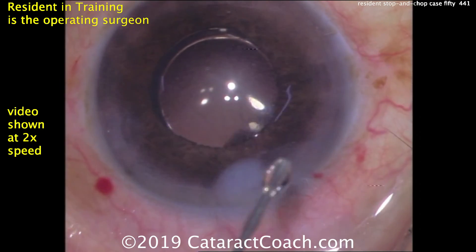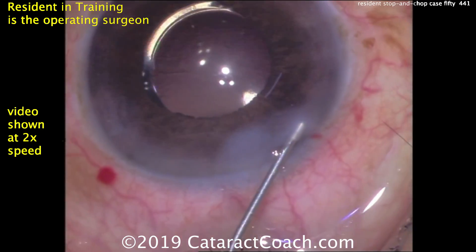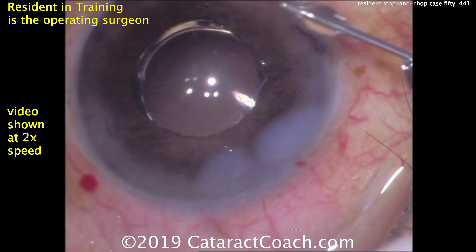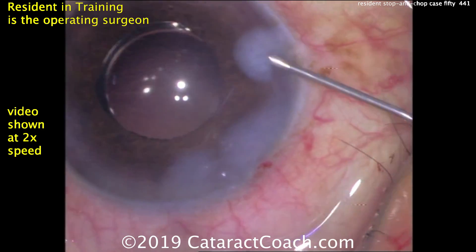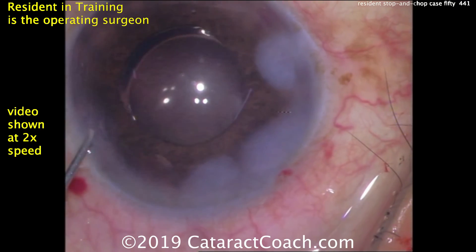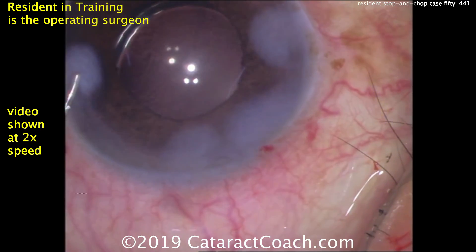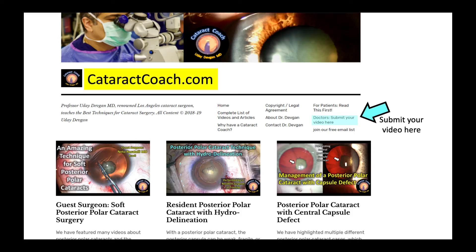Great job by this resident. Now sealing up the incisions. This corneal hydration is a little excessive — a little bit more than I would normally do. Remember it's only a temporary measure, and this much can cause some changes in astigmatism in the early post-op period. It'll all resolve and there'll be no astigmatic issues later on.